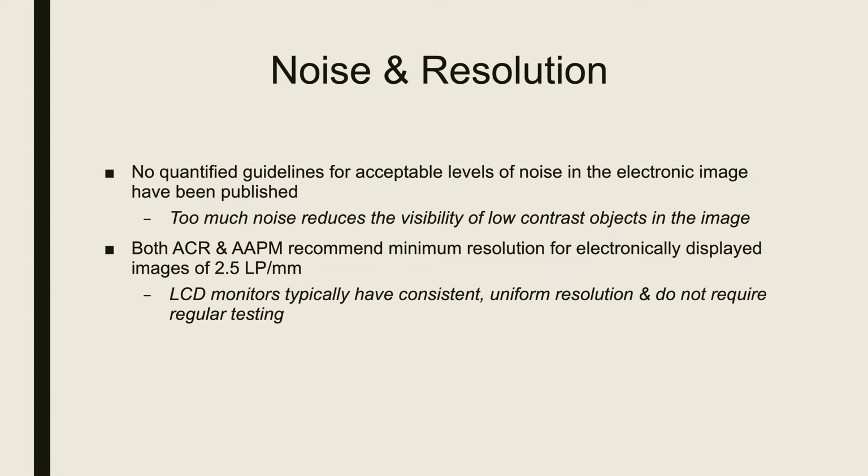Noise and resolution are two different things that are also measured or looked at on the monitor. Interestingly enough, there is no quantified guideline for acceptable levels of noise in the electronic image. But we do know that too much noise will reduce the visibility of low contrast objects in the image, so a radiologist might miss something if you have too much noise.